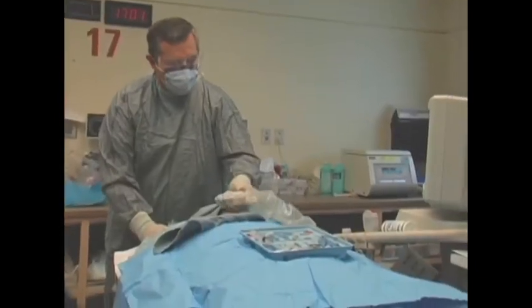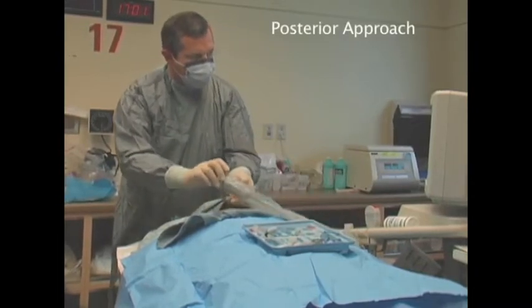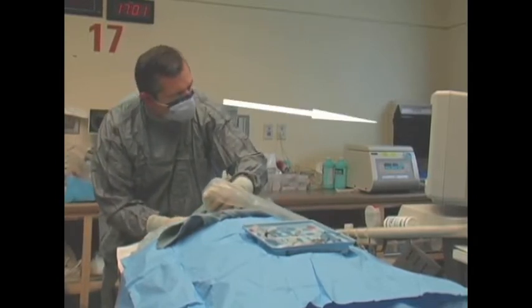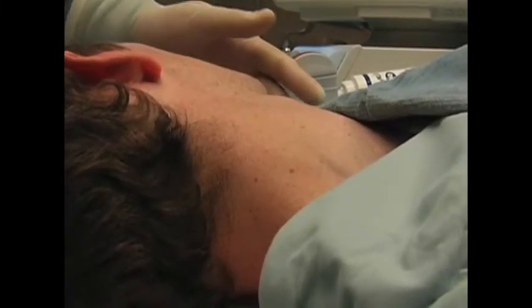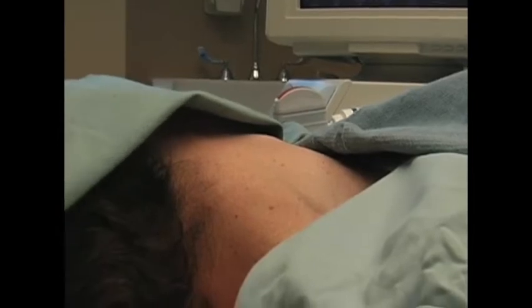Now that we've demonstrated the middle approach, we'll move on to the posterior. Dan has placed the machine on the patient's left side, so once again the screen is in his direct line of sight as he cannulates the right IJ from the posterior approach. The patient has been prepped and draped, and the ultrasound is already in its sterile sleeve.